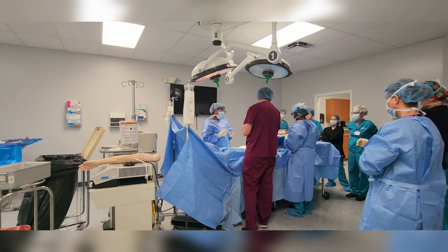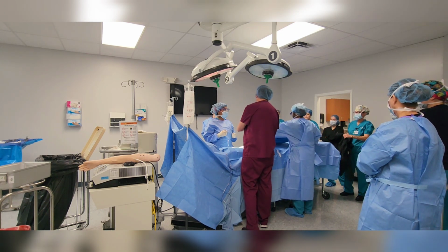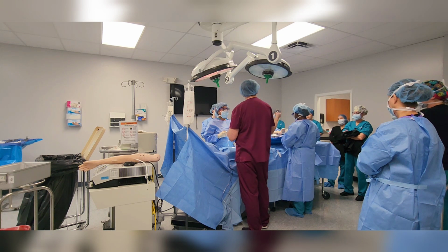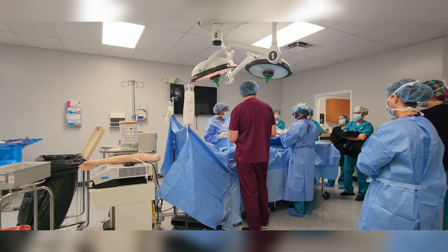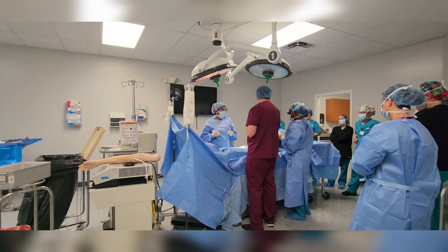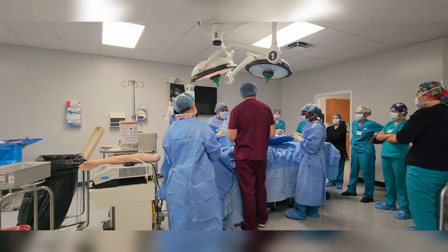And eventually I want everyone to do that. And when you pass it, obviously it needs to be clamped, and you make sure you get it firmly in the hand. And then I'll correct you if I see it. It's just a good approach, to make sure the doctor's feeling it right, unless you're a neurosurgeon. No, it doesn't really matter, as long as you know what the instrument is. Wherever it's going to live, if they throw it back on here, Brooke, make sure you put it right back where it originally started. It really is a good philosophy to keep.